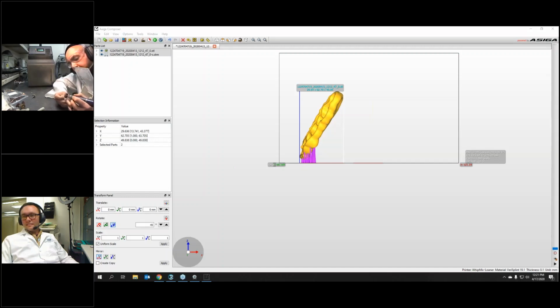So while I did switch over to the fine grit wheel, I went ahead and changed my speed to 12,000 RPMs. I guess I don't need to say RPMs per minute because that's kind of repetitive, isn't it?